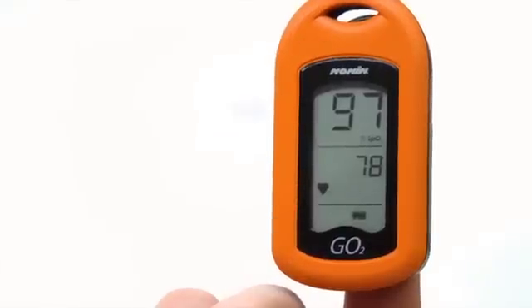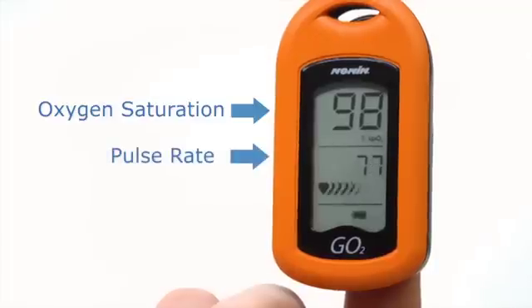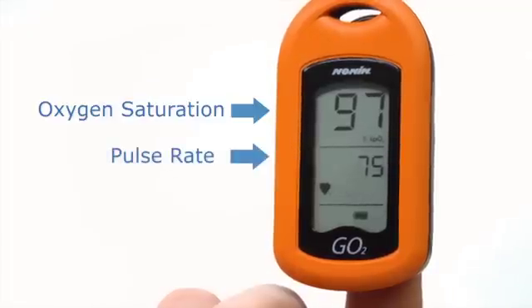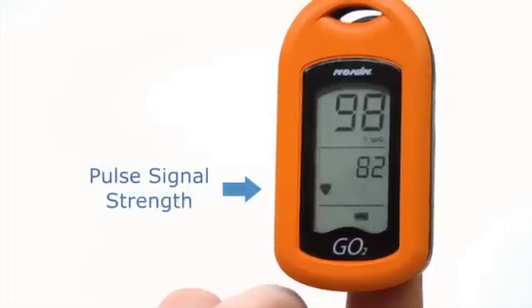Your oxygen saturation, known as SpO2 percentage, is displayed on the top with your pulse rate below. The Pulse Signal Quality Indicator will display a line of hearts — the more hearts, the stronger the pulse signal strength.